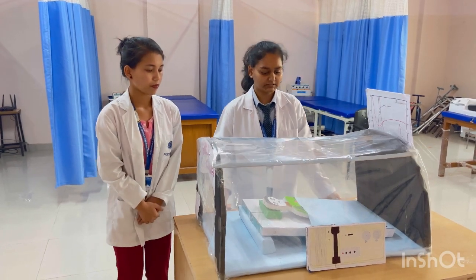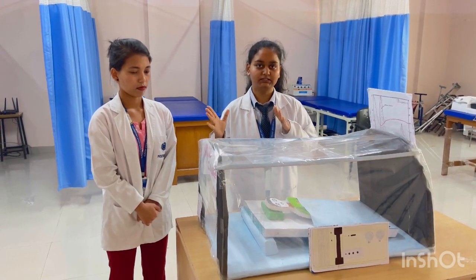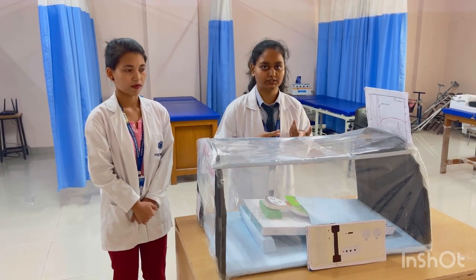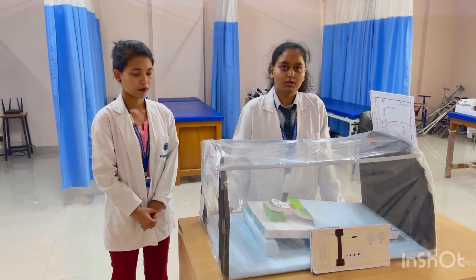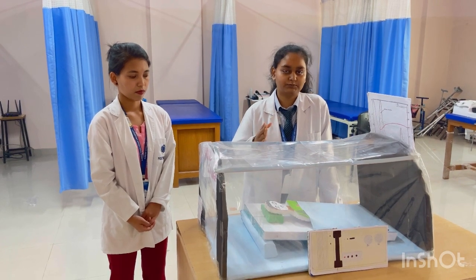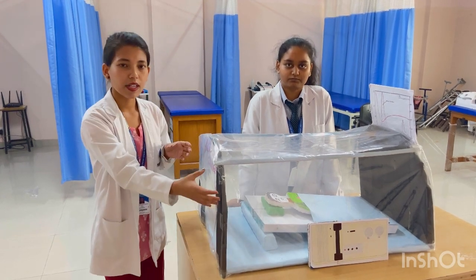There are certain risks when the patient is receiving the treatment. The air pressure outside is normal, and inside the chamber there is two times the air pressure. So there is a risk of lung collapse. To prevent lung collapse, we have to follow the proper procedure for the patient. And in order to avoid oxygen toxicity, we have to monitor again and again.